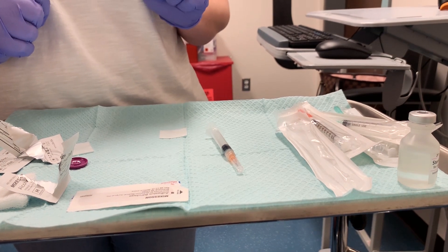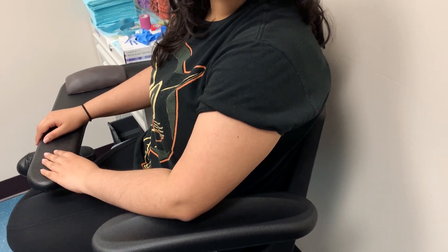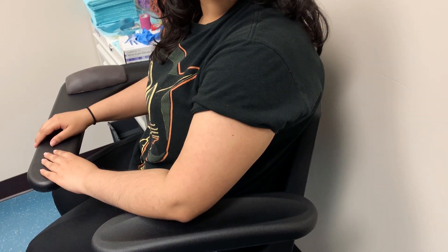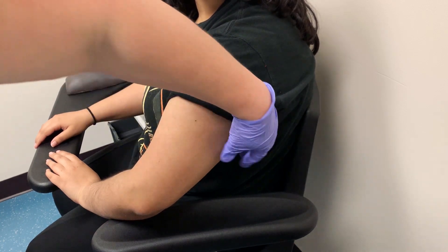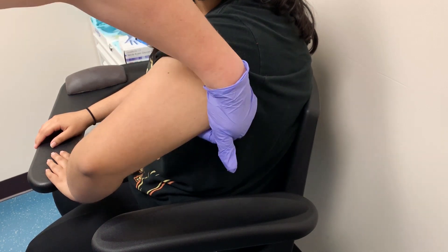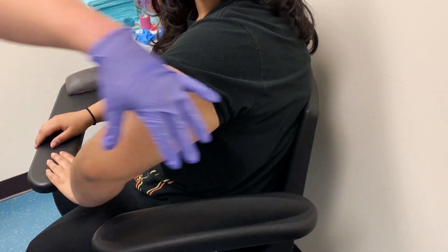We'll pause for a moment while we reset the camera and then do the injection. To give the patient the subcutaneous injection, we have all our supplies prepared: alcohol pads, band-aids, and our medication. We are going to first locate the area for the injection — on this patient we're doing the subcutaneous tissue on the back of the arm.